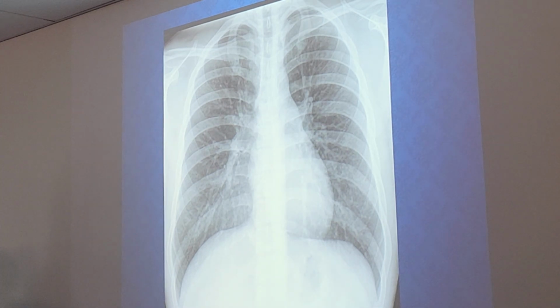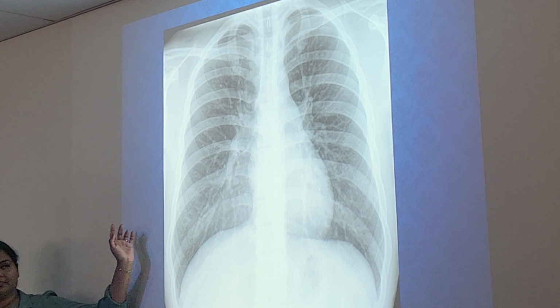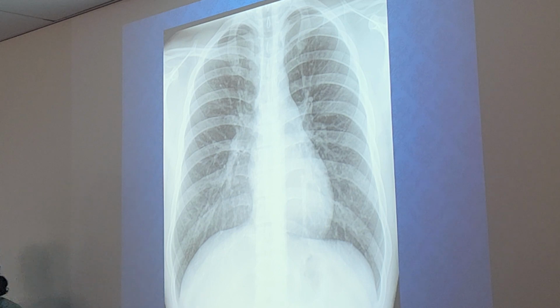So, we're talking about how our images are oriented. We already said that, how do we view images? As though the patient's facing you, correct? So, this side is the patient's what? Right. That side is the patient's left. Okay. But what projection can we assume this is? PA. How do we know that? Clavicles, heart shape. Yes. Would the marker need to be also PA? If it was, that would show you that it's PA.